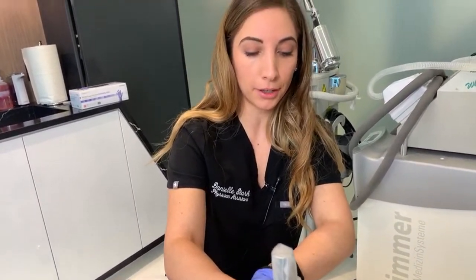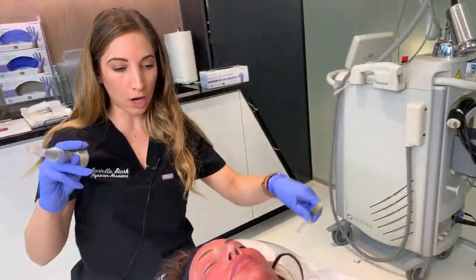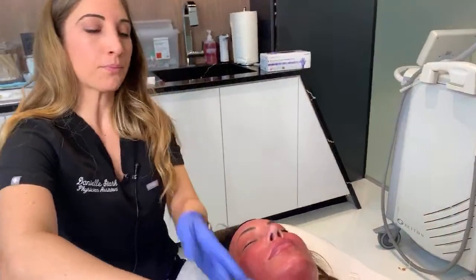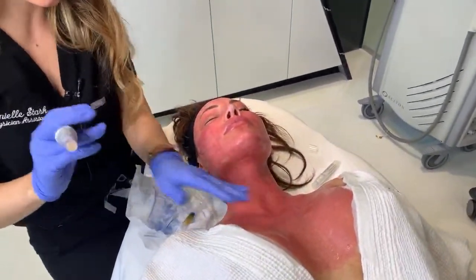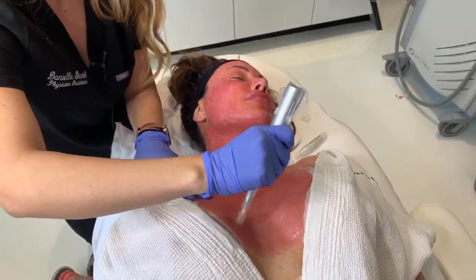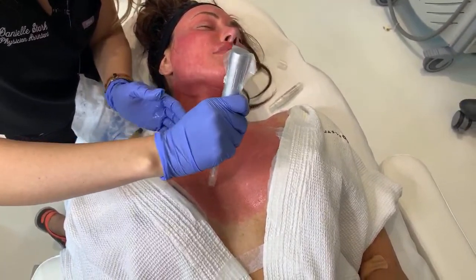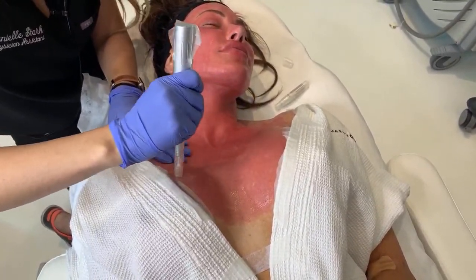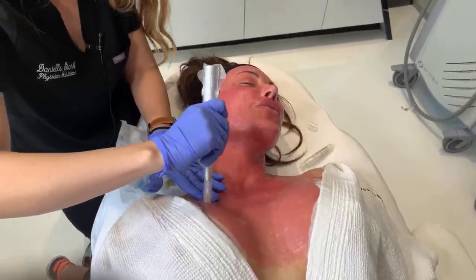So one of the great things about Erbium, the laser itself, is that it targets water more so than just ablating the skin. So it's not considered a painful laser, it's considered a cool laser, but it develops heat afterwards. So that's why she's feeling really hot at this point. It has a very light downtime, or a little bit more aggressive, almost comparable to CO2.